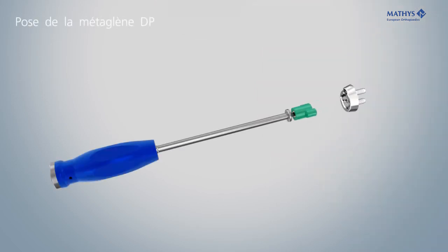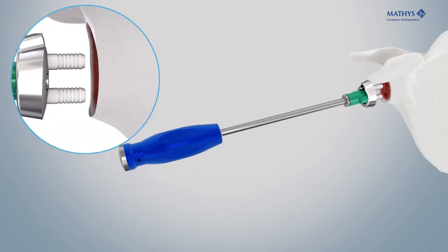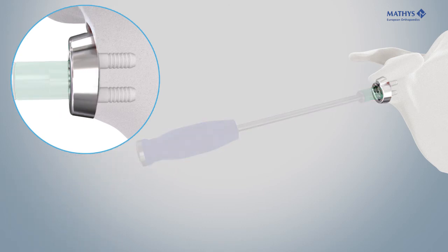Screw the adapter onto the impactor and place the metaglene onto the adapter. The metaglene is implanted with carefully controlled hammer strokes until it abuts flatly on the resected glenoid surface.